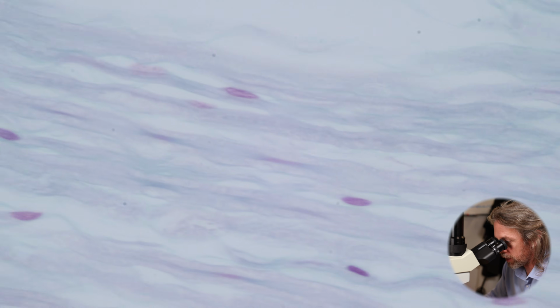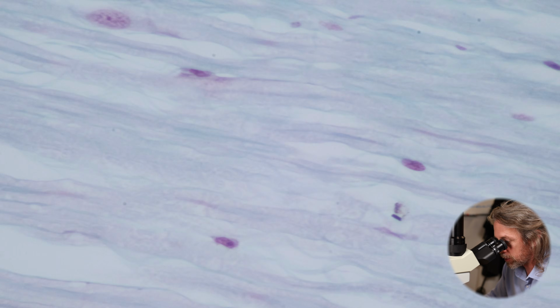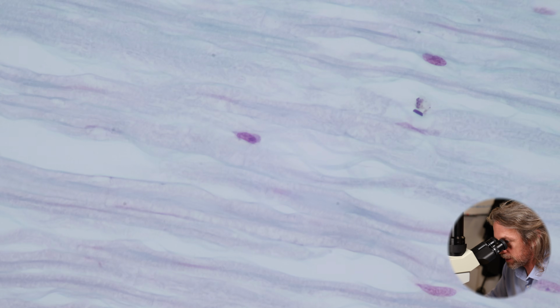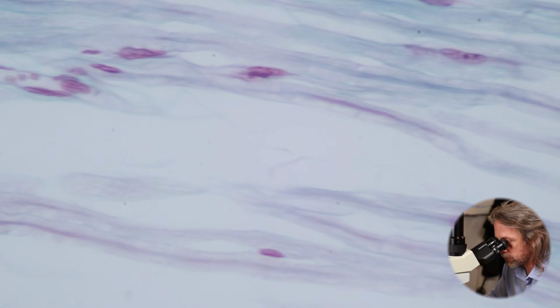So the nuclei that we're seeing here, these will be the nuclei of the support cells, the Schwann cells and the fibroblasts, making the little bits of connective tissue around the outside. Got some very big nuclei. Okay, anyway, right.